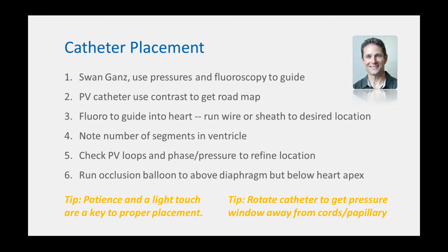And this is sort of the tricky part. You've spent all this time prepping the animal. Now you want to see your data, but 5 more minutes of patience and refining, and you'll get really beautiful loops.